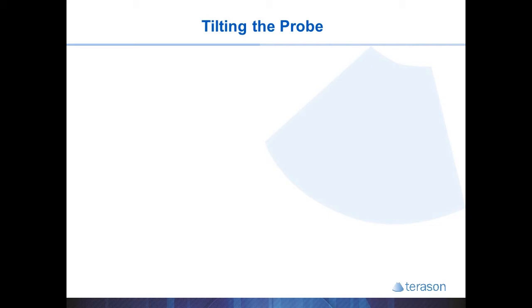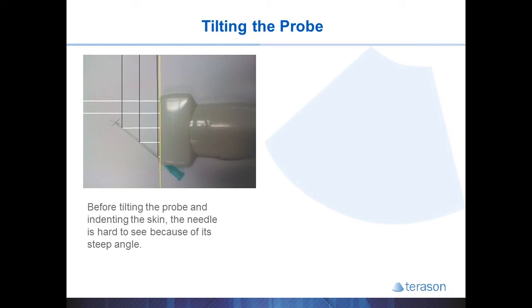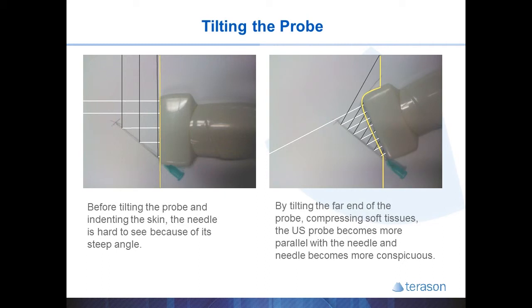If your patient has excess soft tissues, or you're in an area with a lot of soft tissues like the hip, you can learn to tilt your probe to make the needle a lot easier to see. In this example, a 45 degree angle makes the needle more difficult to see. If you compress the soft tissues by pushing the far end of the probe into the soft tissues, you can effectively decrease the angle between the probe and the needle, making the needle much easier to see. Be careful not to compress something you're trying to target, and be mindful of pressure in tender areas.